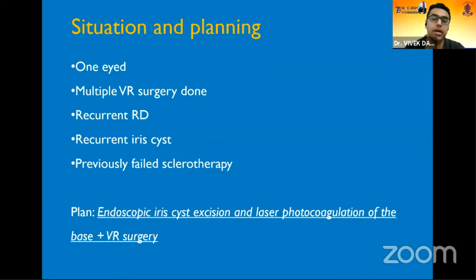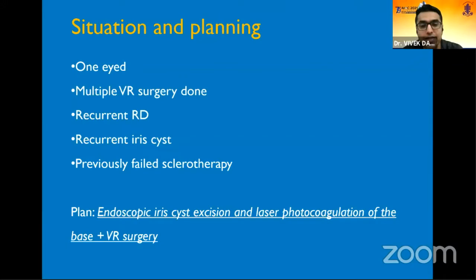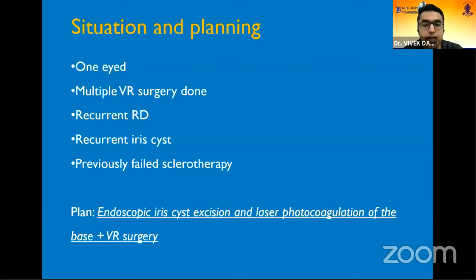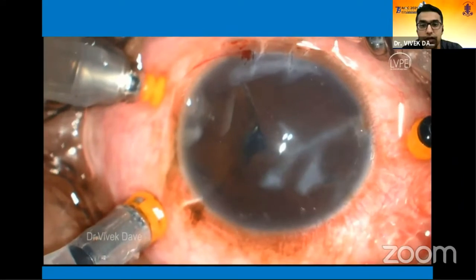Looking at literature in relation to iris cysts, they are notorious for recurrences. These recurrences occur because of residual epithelial cells of the cyst which can propagate and reform the cyst over time. If we can collapse or excise the cyst and ensure no viable cells are left behind, that would be the best way to ensure no recurrence. This is how the surgery proceeded.